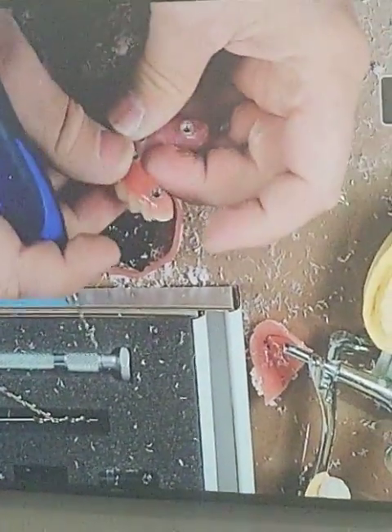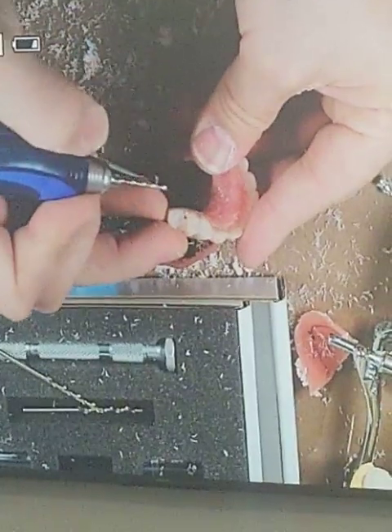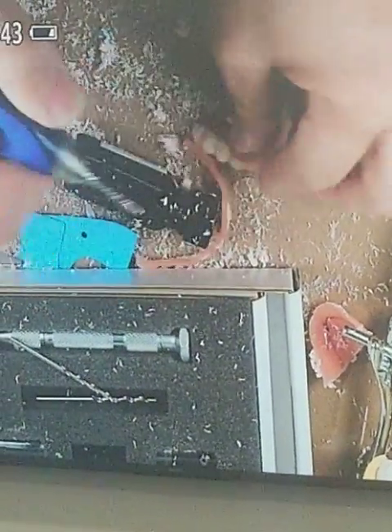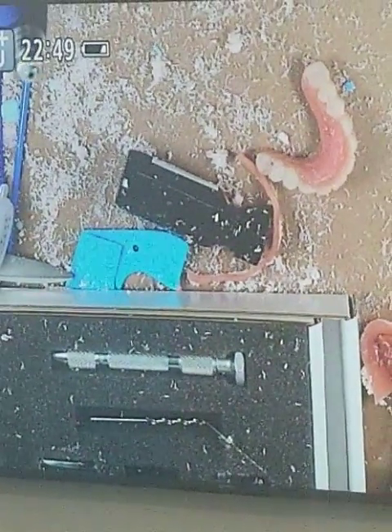And then I just go down. So you can see here, there's just a little hole. You see that? Next step — now I would do all of them before I move on to the next drill.